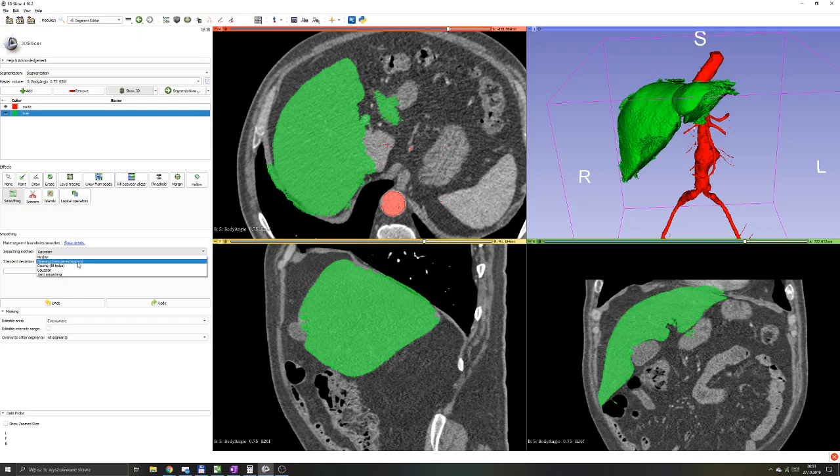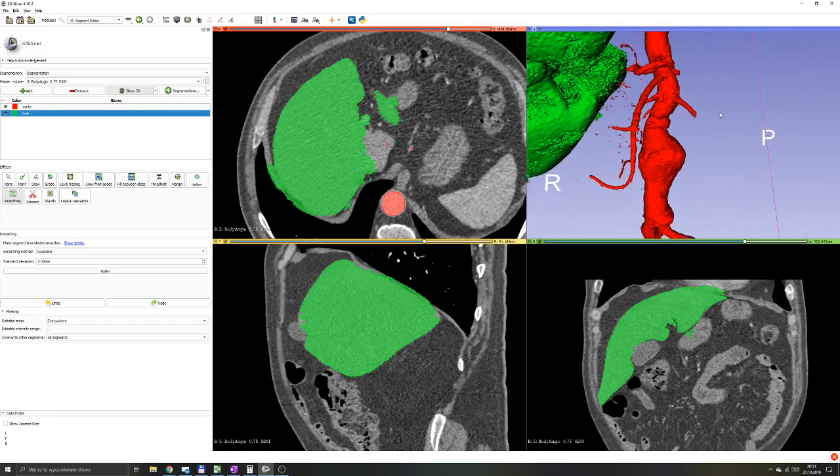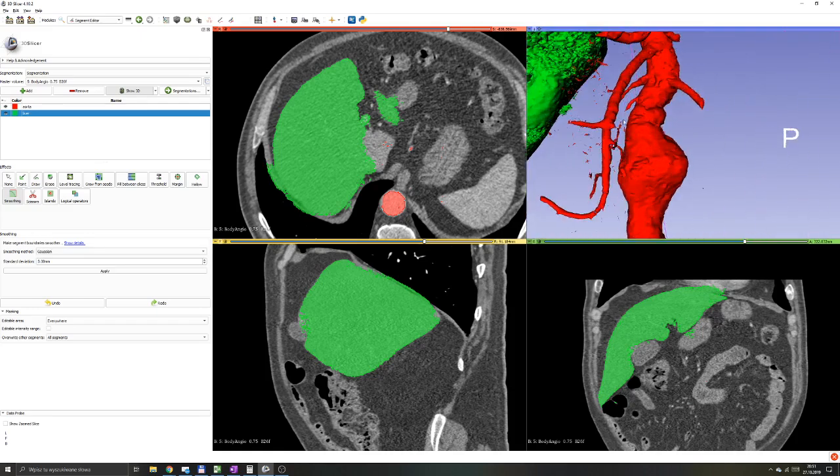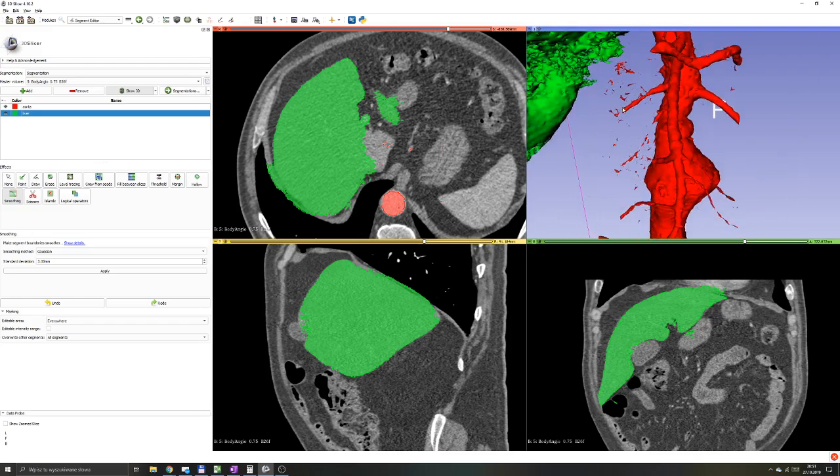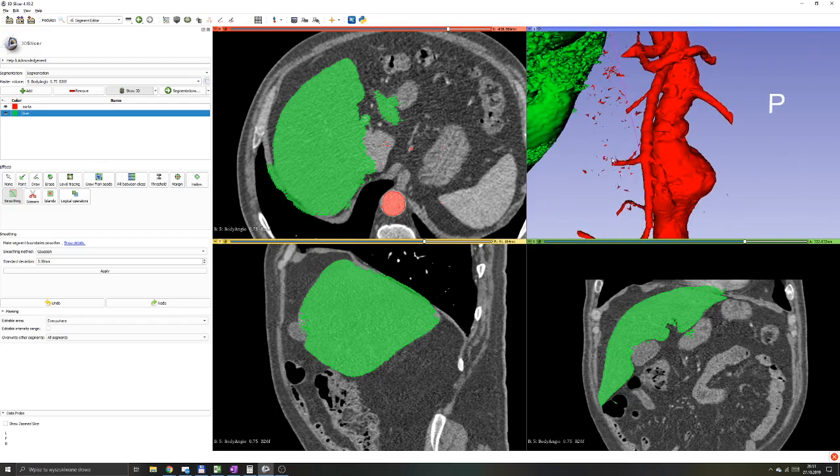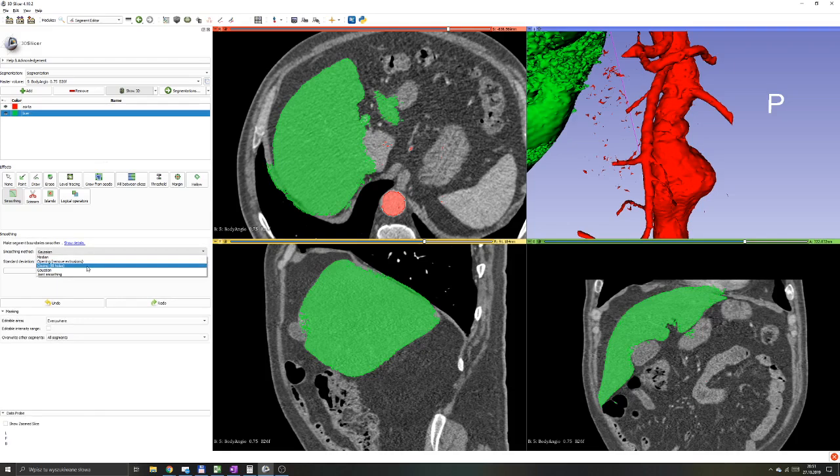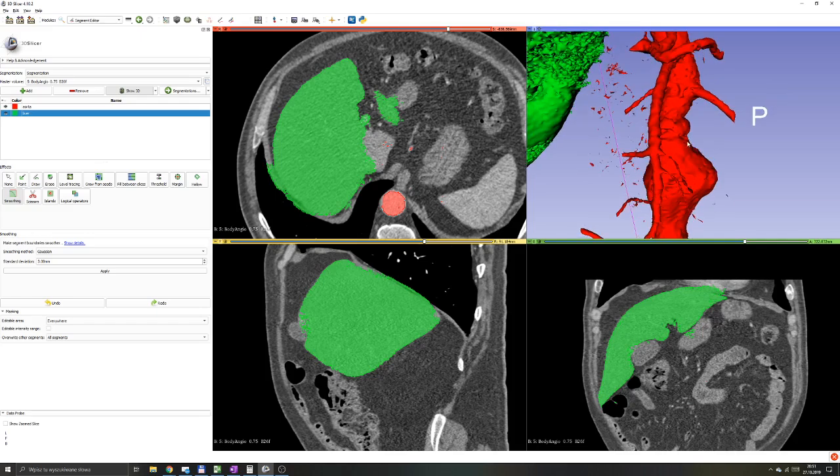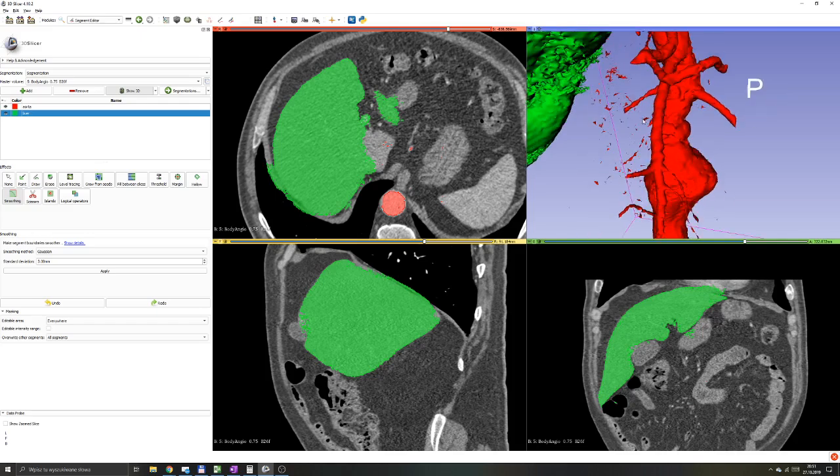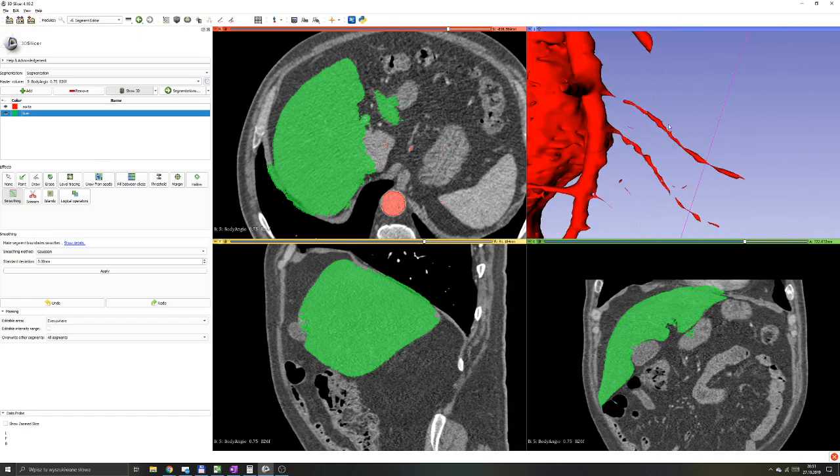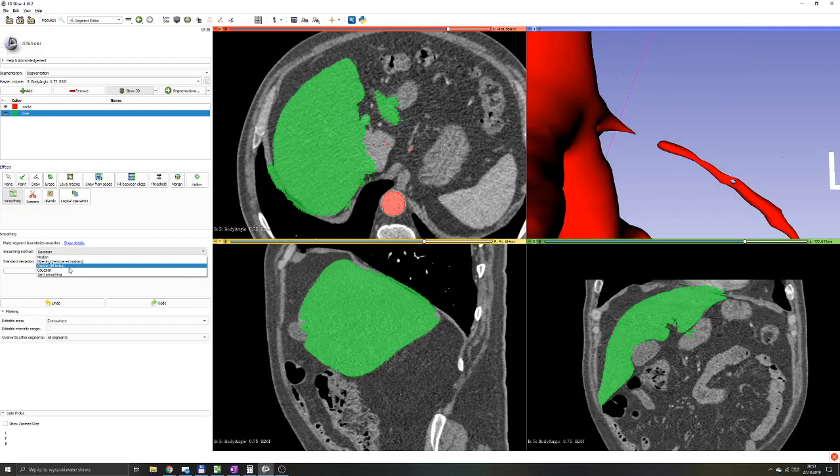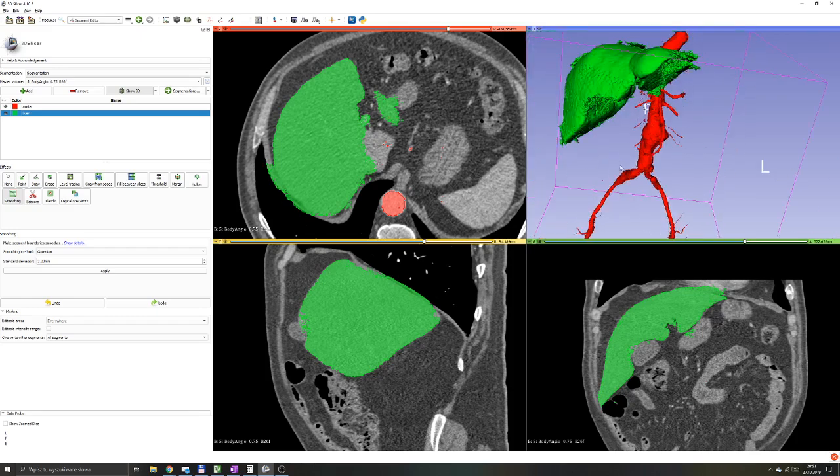Then you have your opening and closing algorithms. As it says, the opening is used to remove extrusions. It will be good later for the aorta model where we have those little bubbles and little points that we would like to remove. Closing will be used if we had the different situation when we would have little holes in our model. Let's say in this aorta, if we wanted to fill that little hole, then algorithms such as closing would be perfect.